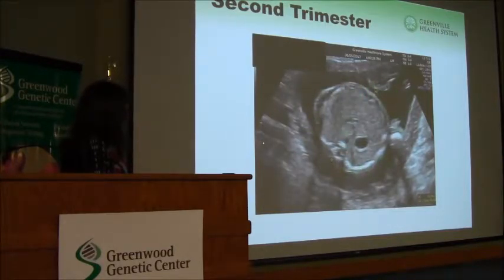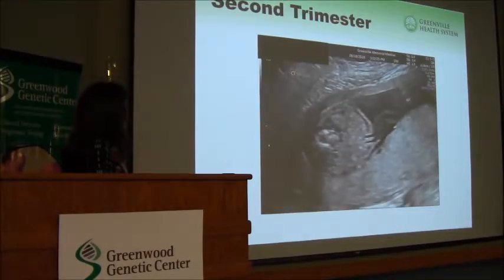We always check the size of the fetal abdomen as part of our biometric measures in the second trimester. This is a cross section, so like you'd see in the CT scan. Most of the fetal abdomen is the fetal liver, and that's why in women that have uncontrolled diabetes, that baby's processing all of that extra glycogen sitting there in their liver, and they get these fat little abdomens. This is a stomach bubble here. It's a single isolated cystic structure, no double bubble like you might see with a baby with Down syndrome that had pyloric stenosis or duodenal atresia.